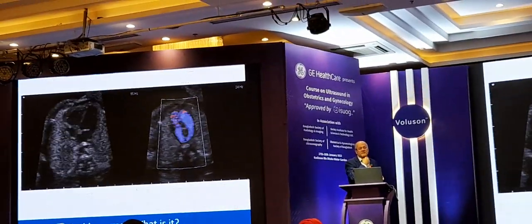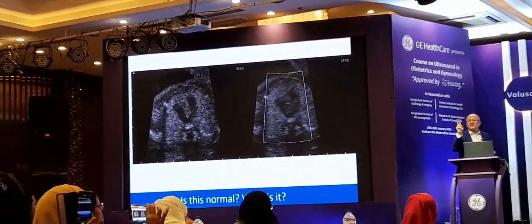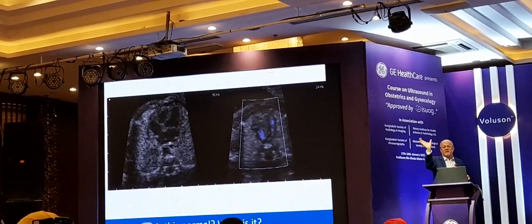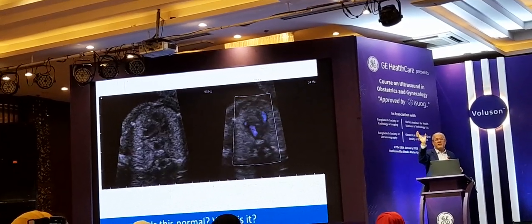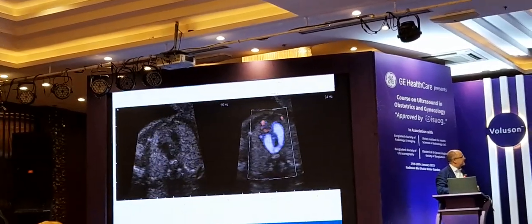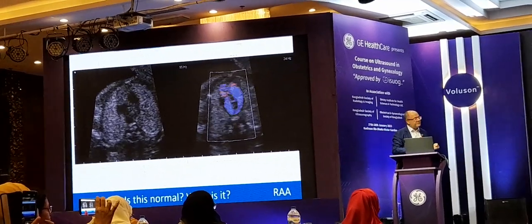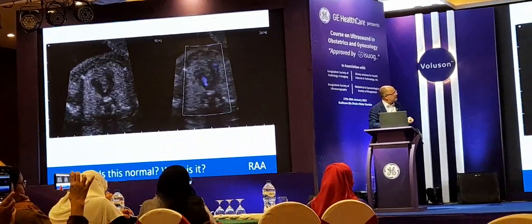Normal or abnormal? Abnormal, good. What is it? Do you have a nice V shape, or is this more like a U shape? U shape. It's more like a U shape, right? Fantastic. So the right aortic arch. In the middle of that arch, structure right in the middle of that.